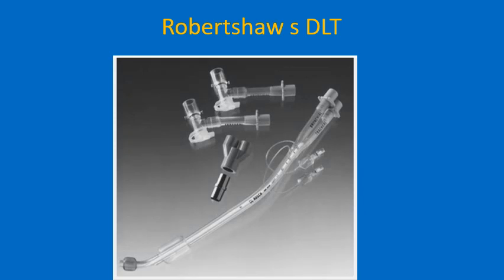Now coming to the Robertshaw double lumen tube. This is nothing but two tubes bonded together. Previously it was available as red rubber tubes. Nowadays it is available as PVC tubes. It has two lumens: one is the tracheal lumen, another is the bronchial lumen.